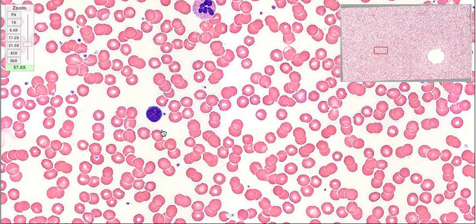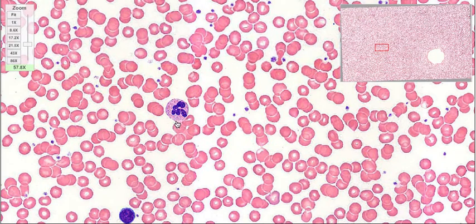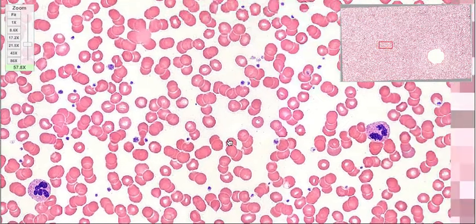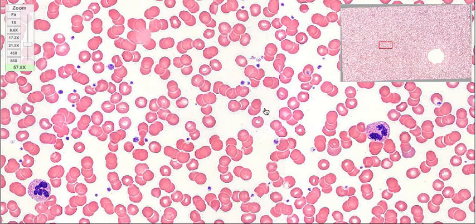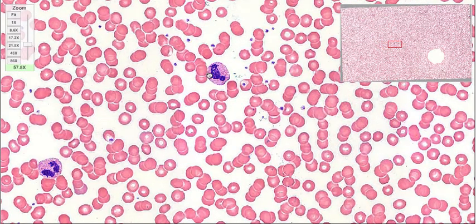And the main distinguishing trait of this cell is, if you have a look at the nucleus, the nucleus takes up basically the whole cytoplasm of the cell. So that's a major characteristic of that. You can't miss that. Here's another neutrophil. Here's another one over here. So essentially, this is what they look like. You can't go by them. There's another one. There's a platelet and lots of red blood cells.